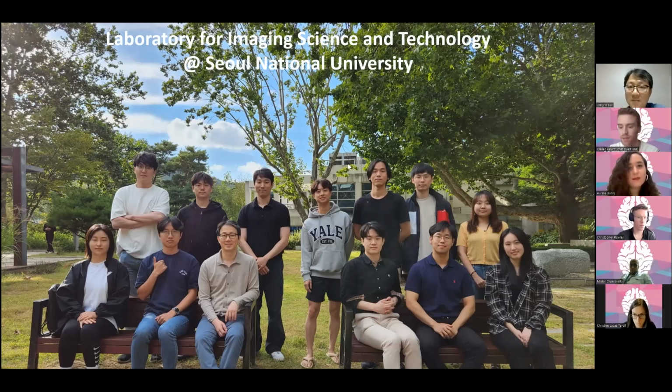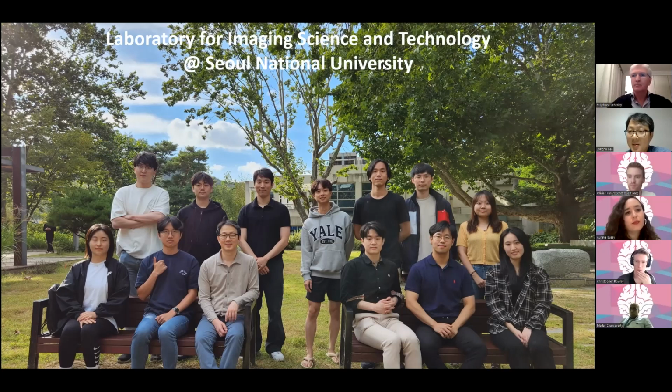Jing Chen, who asks, what's your recommendation for dealing with B0 inhomogeneities? Largely speaking, if you do the good shimming, you can get a pretty large coverage, including some of the temporal lobe. It's exactly the same as the QSM. So in the QSM, you can get a pretty good coverage to the temporal lobe. So roughly you get the same result there. There is no additional processing that we utilize to get a better result of background field.